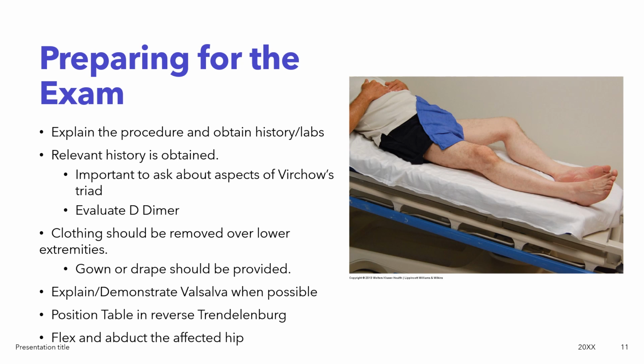Another great tip is that you want to put your patient into the reverse Trendelenburg position, so their heads would be well elevated above their feet. And what this does is it kind of allows some of the venous blood to pool in the legs, in the veins, and that will actually make your scanning the exam easier because the veins will be more dilated.